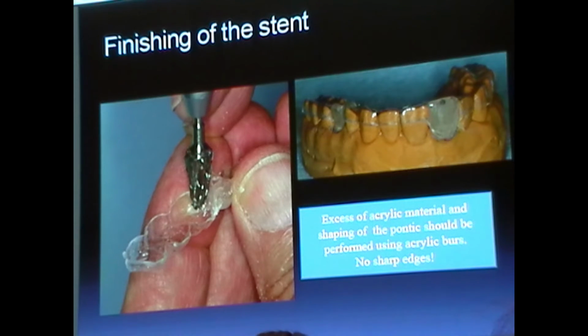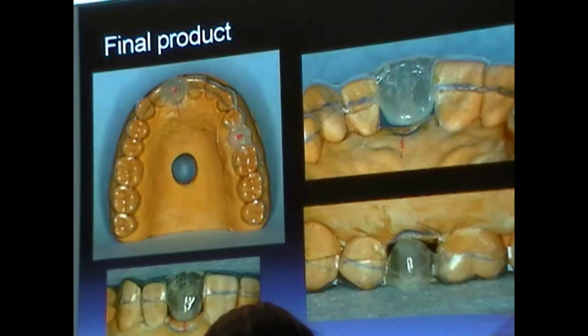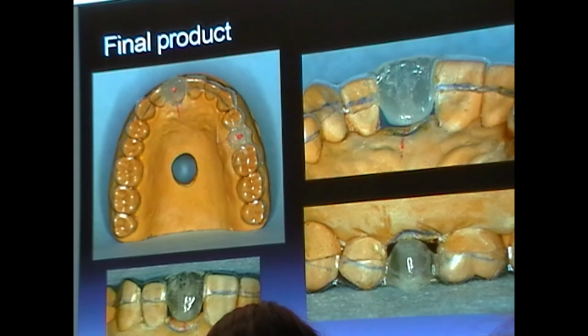What you're going to do is then take your lab cutter materials, not this burr. This would be the burr that you would utilize to remove the stone for your cast earlier on in order to create that center circle for vacuum purposes. I would use the other cross-cut burrs to trim, okay? This is too aggressive for you to trim just for one area, and I don't want someone to remove a nail bit. So ultimately, this is what you should end up with. And we are only going to do the central incisor, so please do not focus on the premolar area.